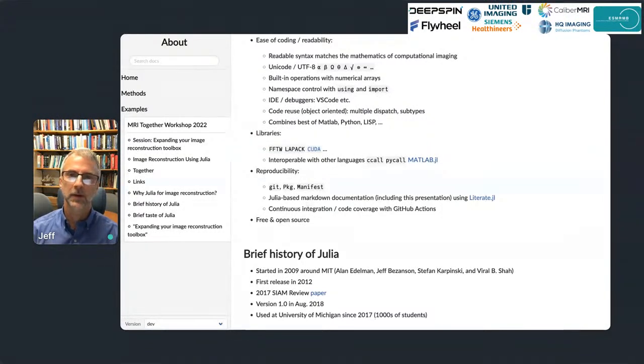I've shared MATLAB code for years in the spirit of reproducibility, but that MATLAB code keeps evolving over time. And if you try to use today's MATLAB version of my toolbox to reproduce a paper that we wrote a decade ago, it may not work so well because of new features we added, or even MATLAB itself adding new functions that conflict with the names of functions that I had in the paper, or the code at some point.